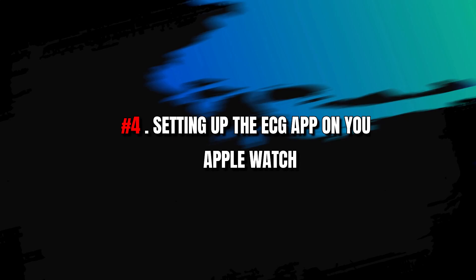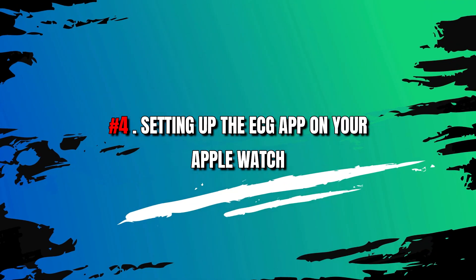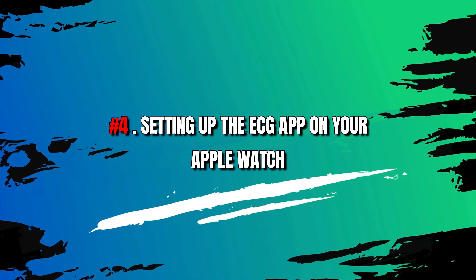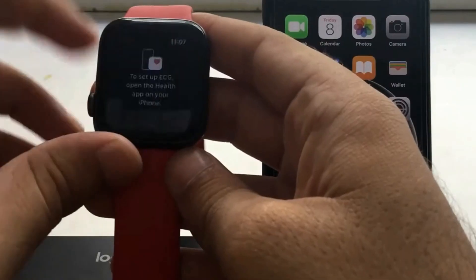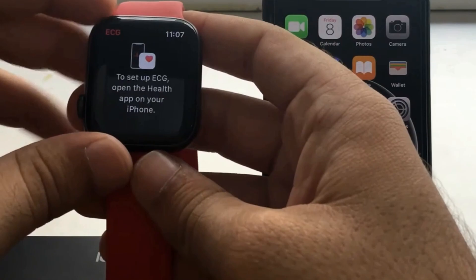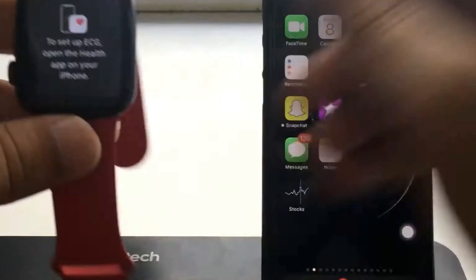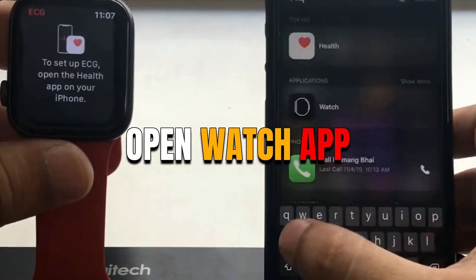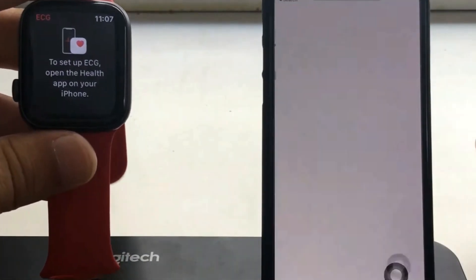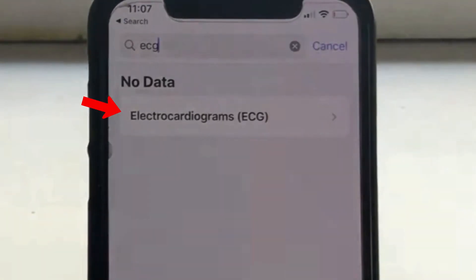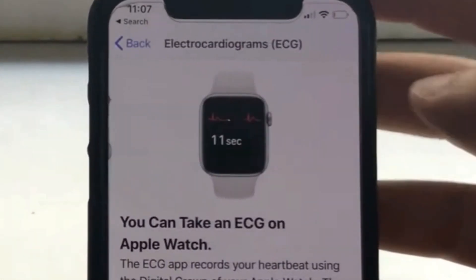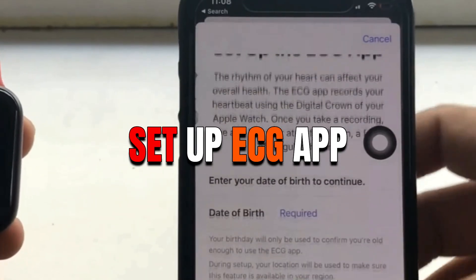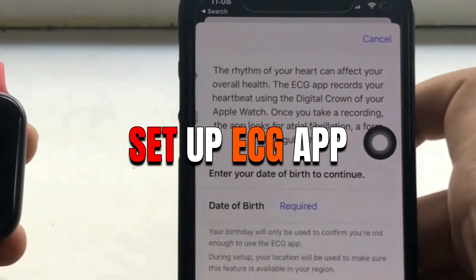Number 4: Setting up the ECG app on your Apple Watch. Make sure your Apple Watch is paired with your iPhone and connected to the internet. Open the Watch app on your iPhone, scroll down, and tap on ECG. Read the info about the ECG app and select Set Up ECG App.